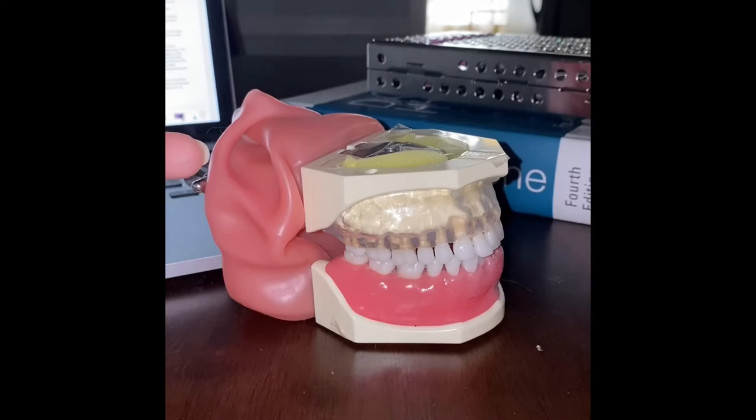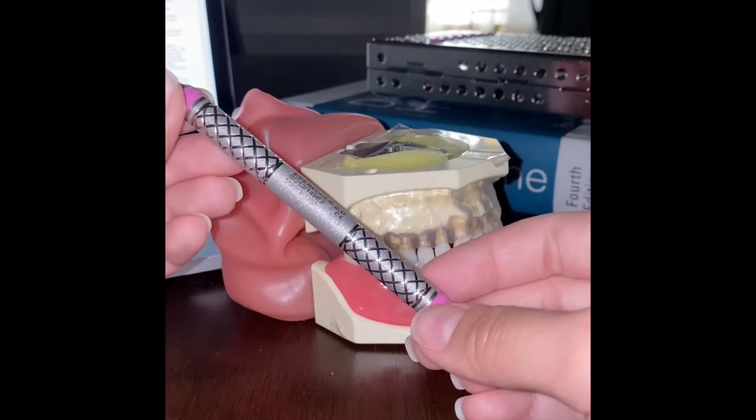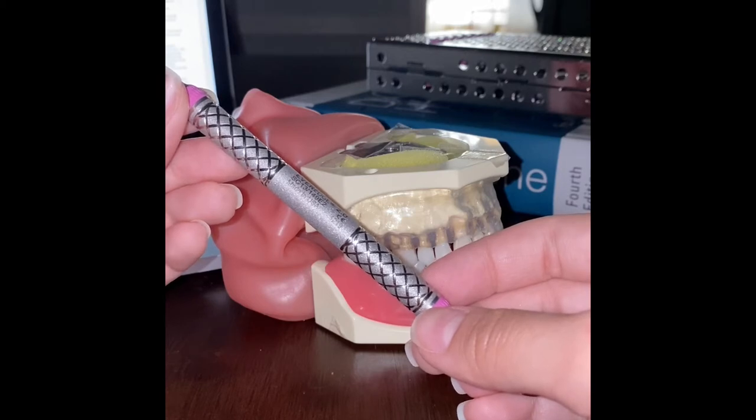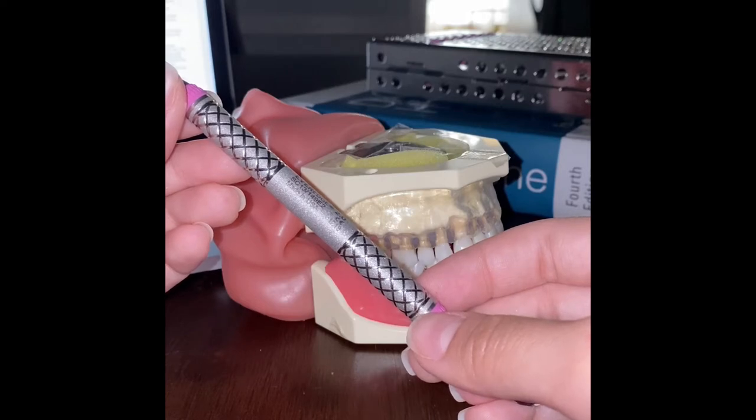For the Universal curette, the face of the blade is at a 90-degree angle to the terminal shank. It has two cutting edges and a rounded toe. We fulcrum with pressure on the occlusal or incisal surface. We adapt the instrument using the toe third and insert with a closed blade at a 0-40 degree angle until we reach the sulcus, which we'll know when the tissue blanches.